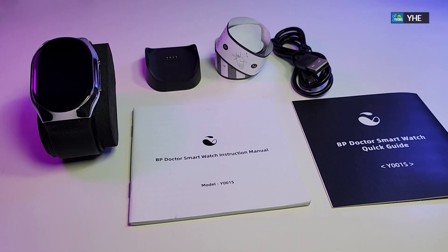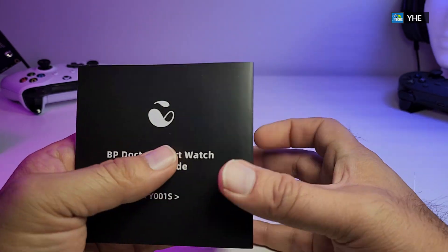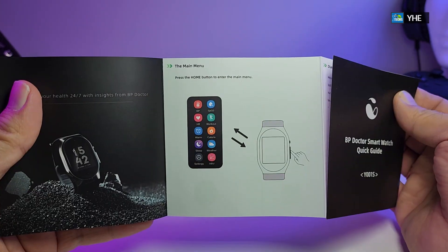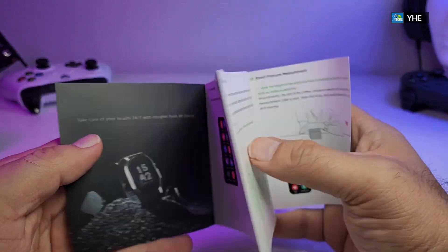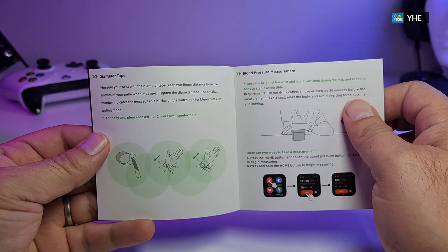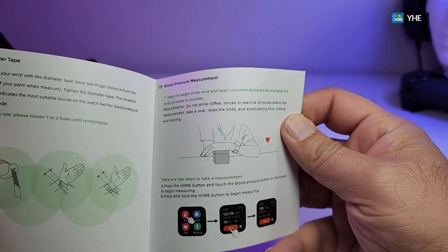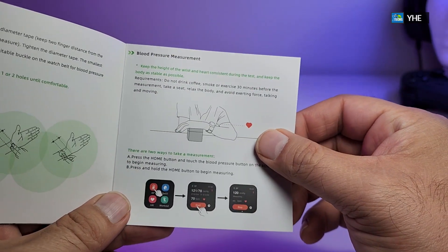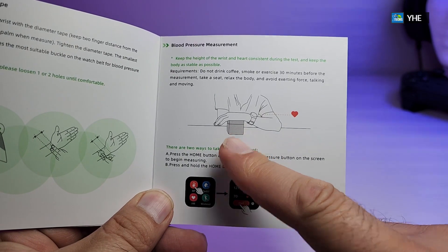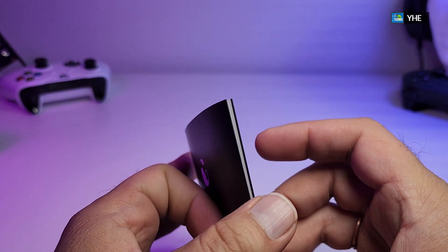These are all the components that are part of the box. It comes with a quick start guide that is just a few pages. Once you open it, it talks about the watch, what type of apps you should use, and how you should be able to connect the paper band that they have sent us. It also shows how to check your heart rate and blood pressure, and all the other parts covered in this video.